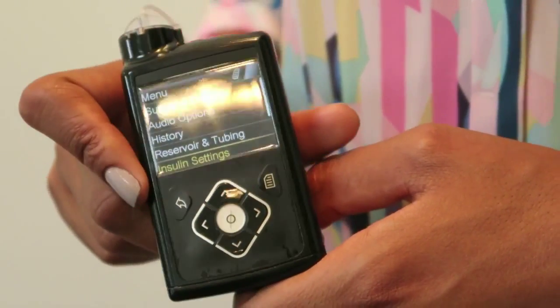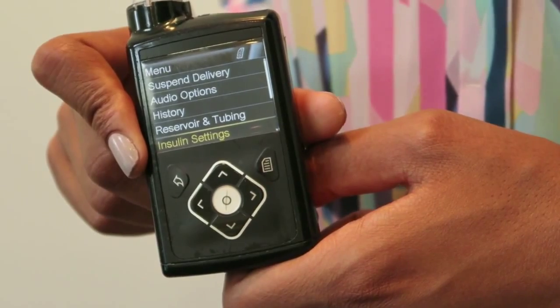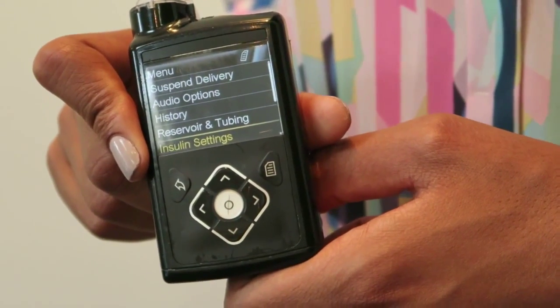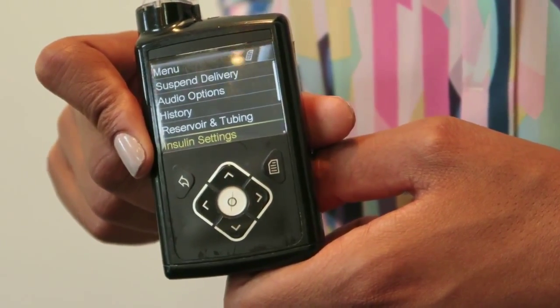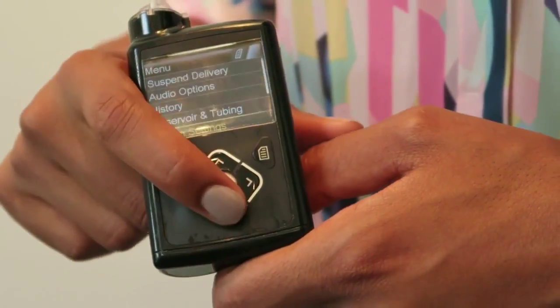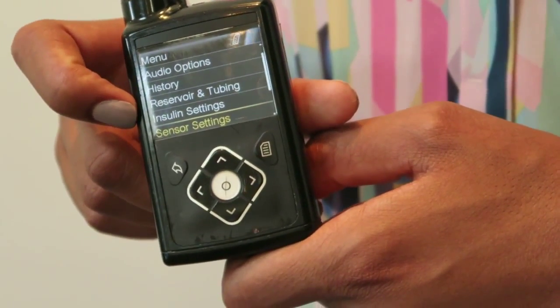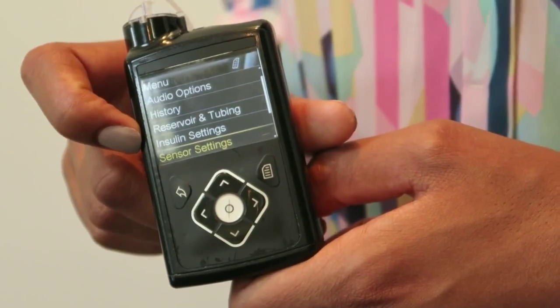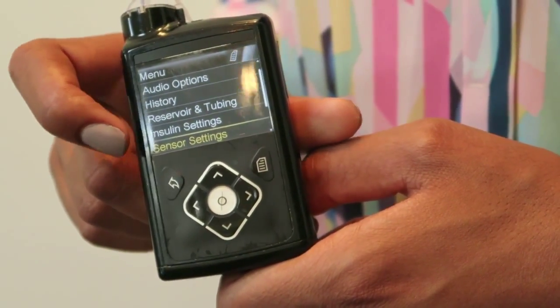We've then got the insulin settings themselves. There's more than one way to give insulin — you don't have to give it all in one go. You can also split up the dose in different ways, so all of those options are in here. The sensor settings are the next option, so if you needed to start a new sensor or reconnect it, then this is the option that you choose.